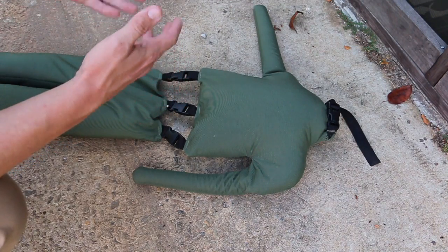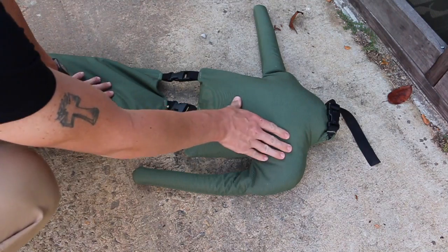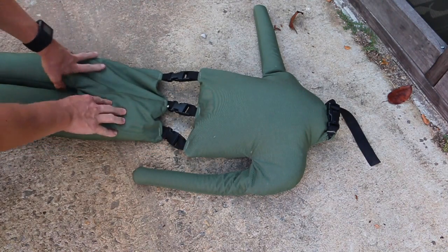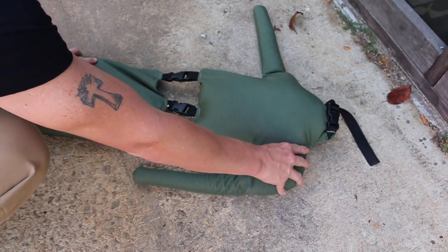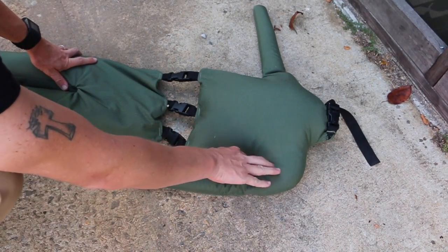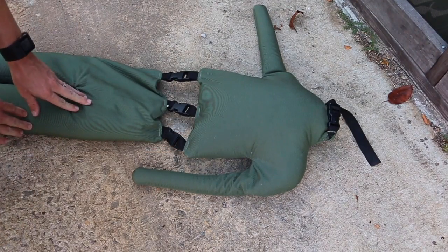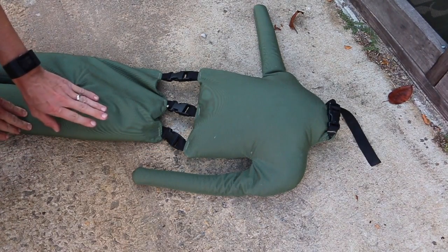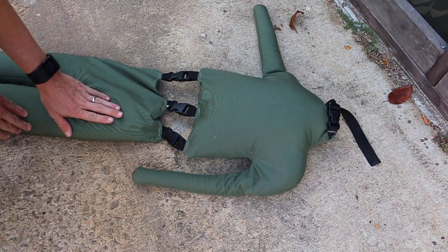Hemostatic agents work really well for axillary wounds — like the armpit up in here — and then the groin as well. We don't do wound packing in the actual torso, but up where the shoulder is, where you can't get a tourniquet up high enough to use it, it works really well for that. Same thing up on the hip — if we can't get a tourniquet up high enough, the hemostatic agent works really well for that.